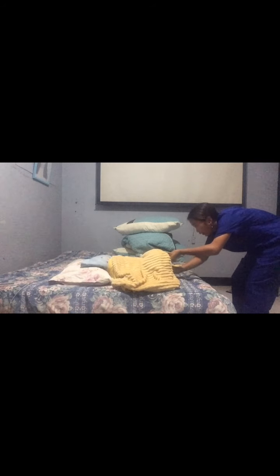Wash your hands. Check the collector every 15 to 20 minutes. Remove collector if already filled with urine and place a clean diaper on the child.